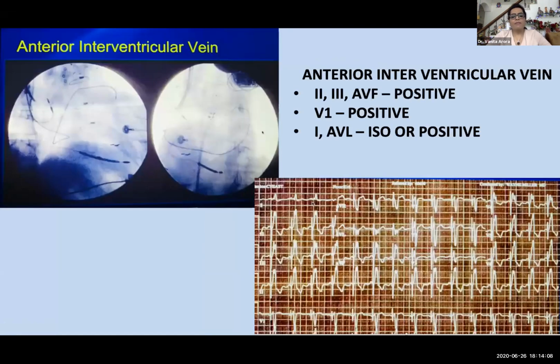In case the lead is in the anterior vein, then you have placed it towards the septum. You have gone in the anterior vein, and instead of going on the lateral side, you have gone towards the septum. And when you are towards the septum, what you will have in the ECG is 2, 3, aVF being positive, lead 1 positive. Even if you have V1 which is biphasic, there is an initial positive response. This cannot be a good position for this patient, and it is recommended that instead of aiming for electronic repositioning, you should replace the lead to a better path.